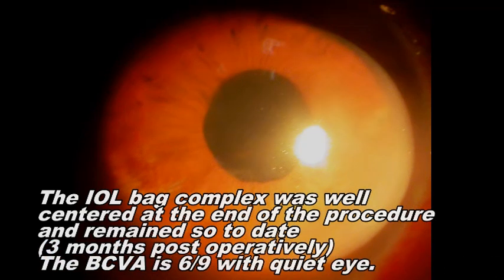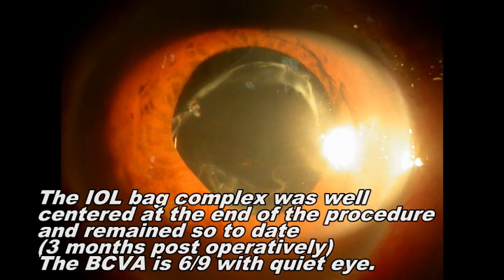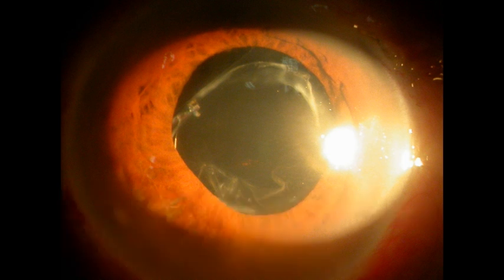to date, that is 3 months post-operatively. The BCVA is 6/9 with quiet eye. These are the post-operative slit lamp pictures. You can notice the well-centered lens bag complex and a quiet eye.